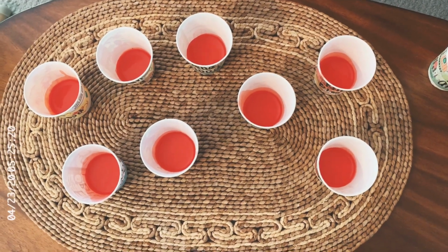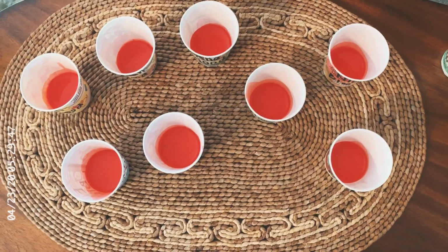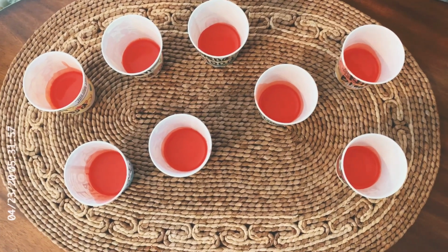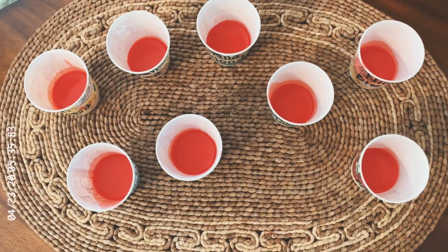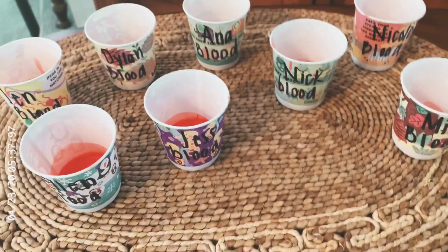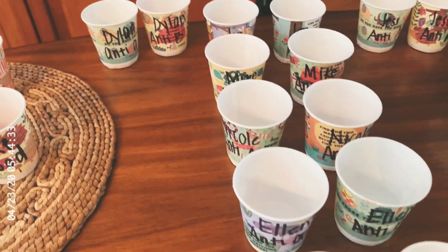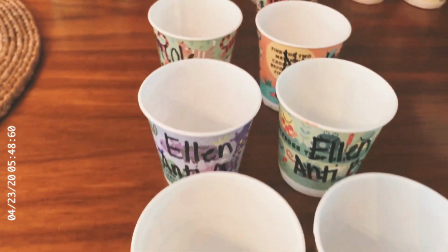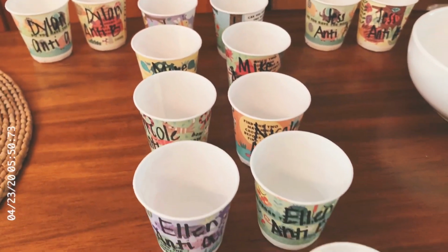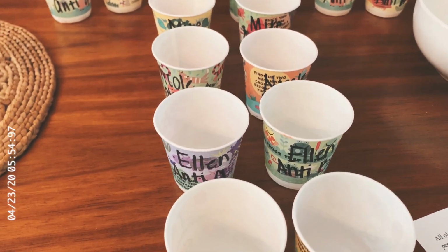Okay, so here we have all the samples of blood from the family members. There are 8 of them, so there's 8 blood samples here. You can see they all look the same, so we can't tell what type of blood they have based on how they look, but I do have them labeled with the family members' names of the Smith family. Over here, I have all the different anti-serums, and I have an A and B to test for each person so that everyone has a sterilized test for their blood type.